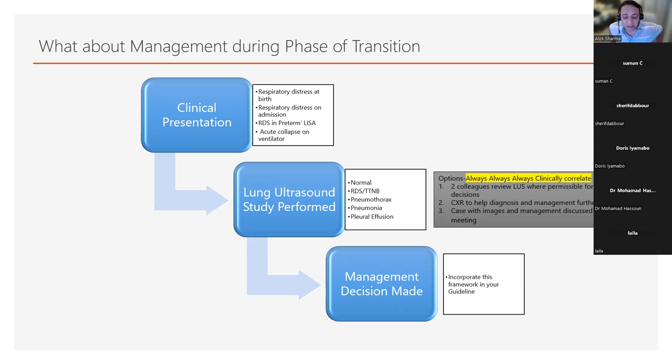A simple example that I'll give you is a baby who does not have any signs of respiratory distress, but who's becoming gradually shocked with rising lactates, is showing signs of hypotension, could have a tension pneumothorax or could have cardiac tamponade. Really, you can make the diagnosis very quickly. On the other hand, you might have a presentation of UVC extravasation with the SAFER R protocol, which presents in a slightly different way. The SAFER R protocol gives you a diagnostic algorithm that asks you to go through certain steps, which is beautiful.